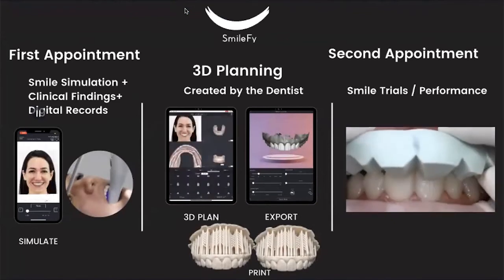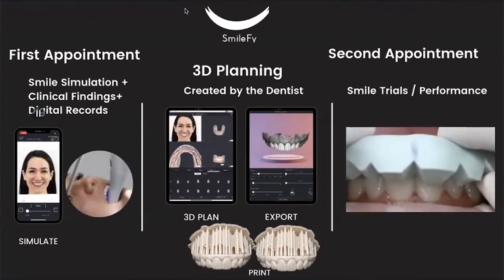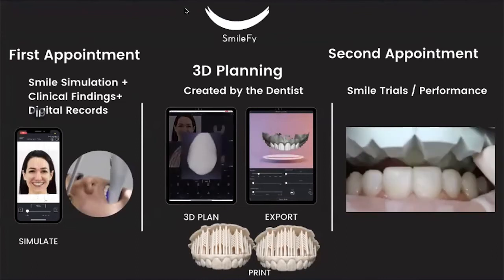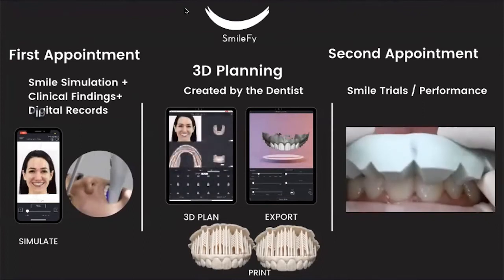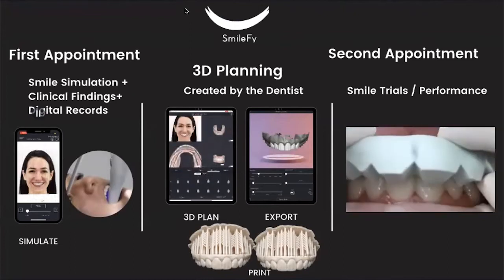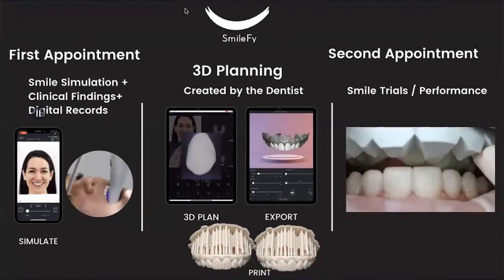I know that many doctors have different ways of performing their own treatment plans, their own ways of creating the workflow for different types of procedures. But here, what I want to show you is how you can make the workflow simpler for your patient so they can better understand the value of the treatment plans that you provide.